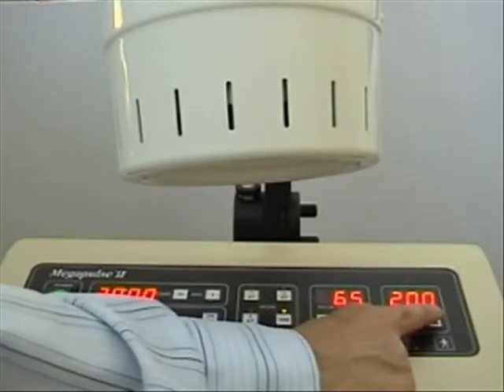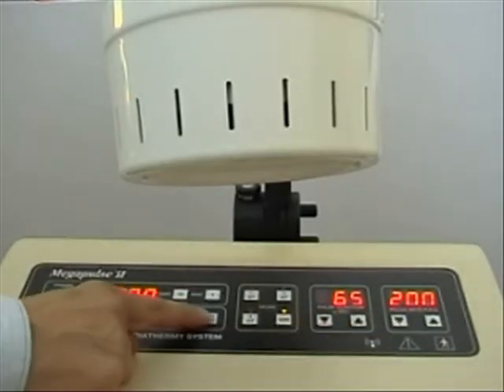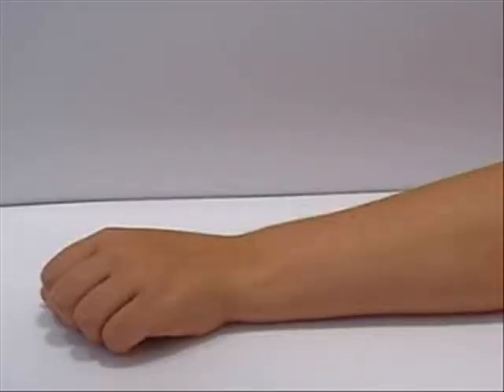The applicator does not need to be in contact with the patient and the clear display on the Megapulse 2 with touch sensitive controls added to preset output modes make for easy setup of treatments.